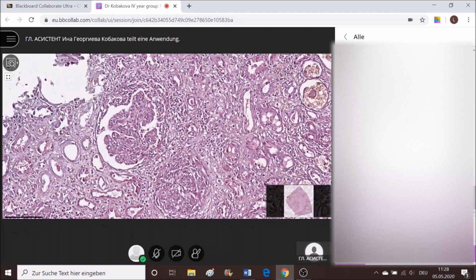Now, due to an autoimmune process, we expect majorly most of the glomeruli to be damaged by the process, since these changes may start in some and be more evident in others, but yet the start of the process could be even observed here, with the proliferation of podocytes and cells here, and the increase of the capillary loops, which can be observed well, and with partial closing of the Bowman space at one of the poles of the glomerulus.